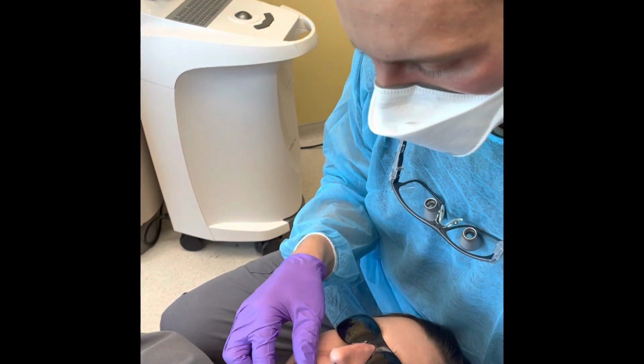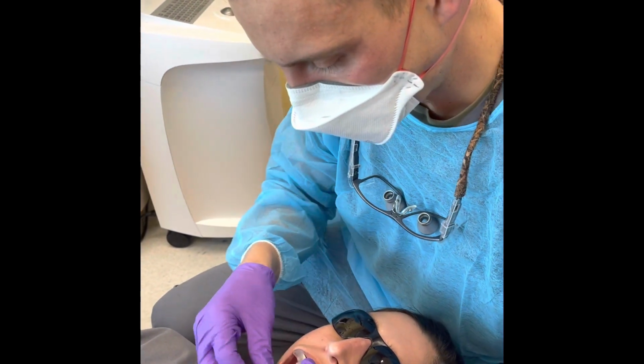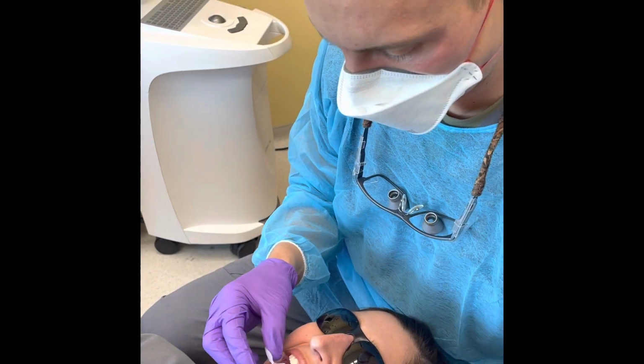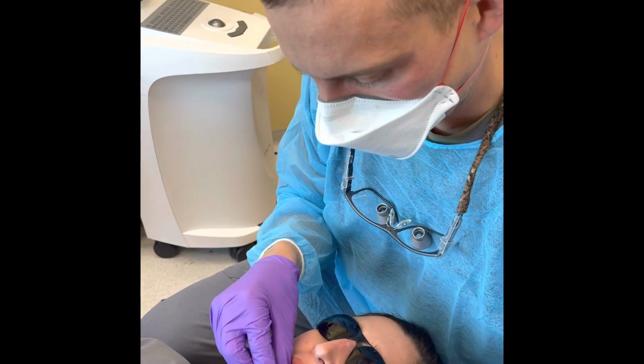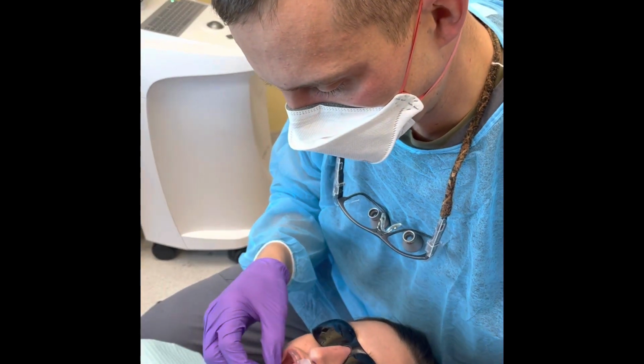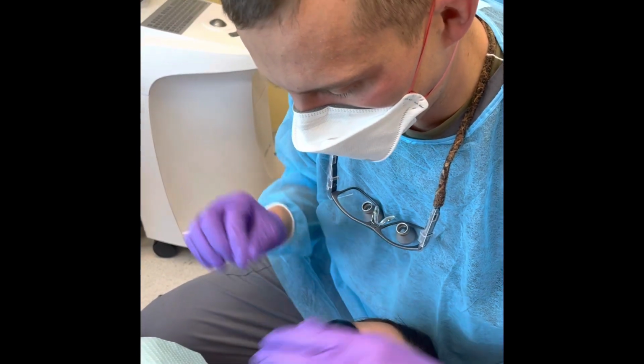All right, and hopefully your tongue finds a little basket. Mm-hmm. All right, let's go ahead and try this again here. This should go in your cheeks, correct? Mm-hmm. Hold your cheeks out of the way. Mm-hmm. All right, excellent. Yeah, looks pretty nifty.